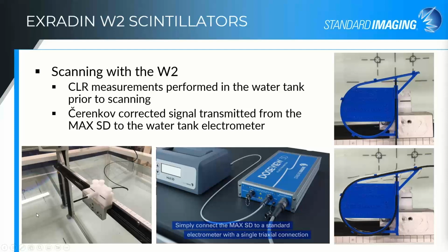The third method you can do is that we have a calibration slab that we designed for the W1. That is an optional add-on to the W2 purchase, but that is a larger flat virtual water slab with a channel milled out for the straight out configuration and a channel milled out for the curved around maximum fiber configuration. And that measurement would be done in a 30 by 30 field. Then there are also markings for the 10 by 10 field calibration if you wanted to calibrate that way.